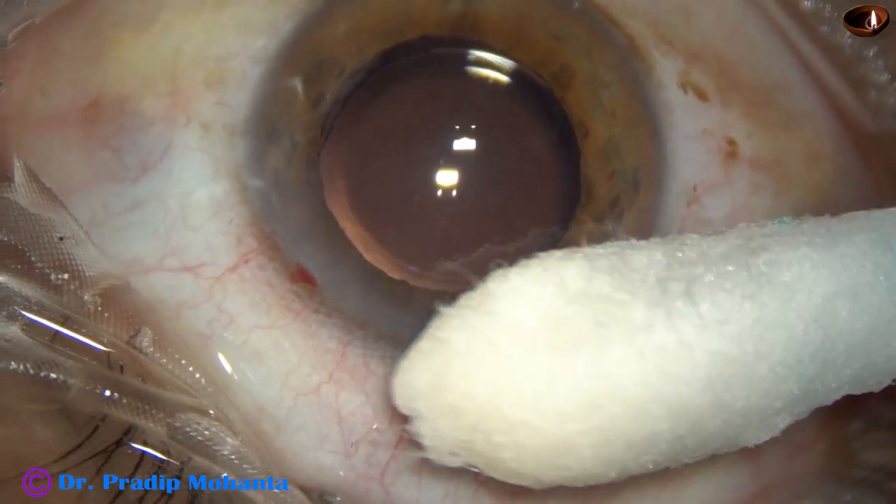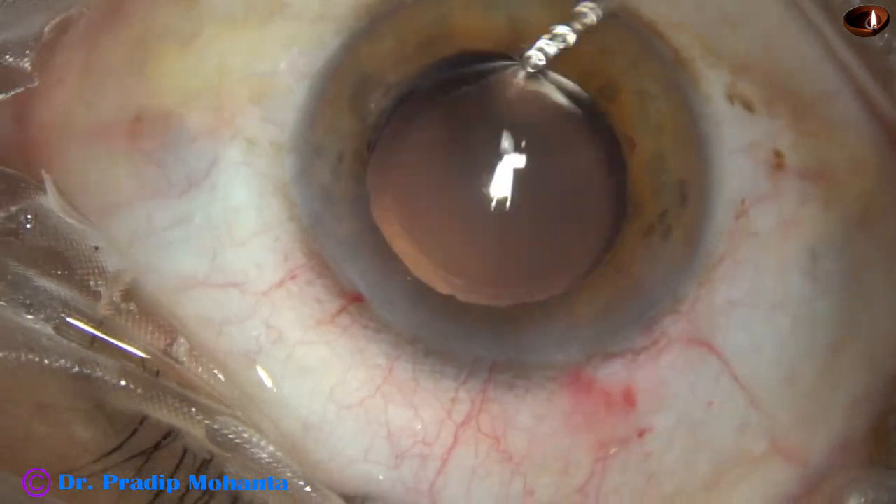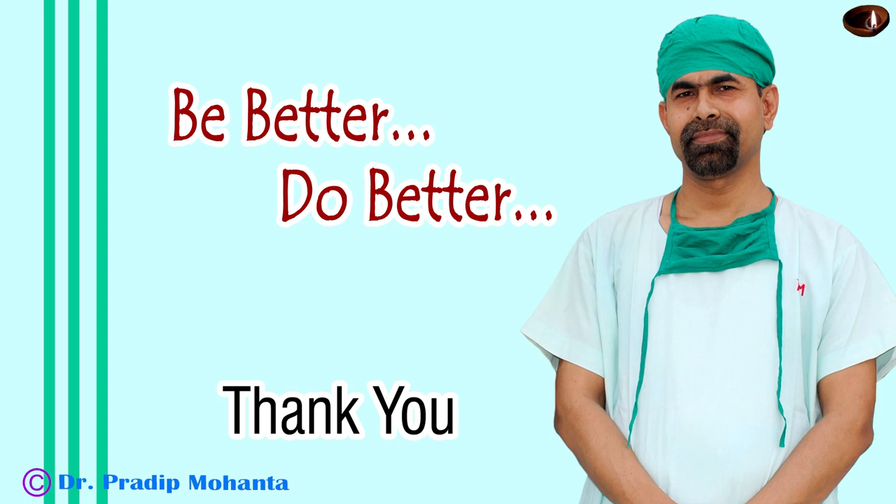We must be very thorough in cleaning up the viscoelastic. The anterior chamber is formed nicely to conclude the case. Thank you very much for your attention. Hope this video will help you in developing your surgical skills. Since diabetic cataracts are very sticky, it is very difficult to hold such nuclei and crack the nucleus into pieces. The pre-chopper plays a major role in such cases.